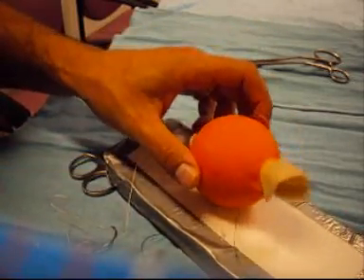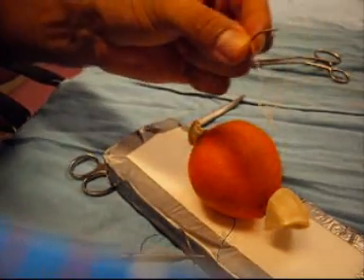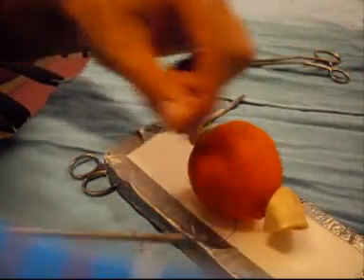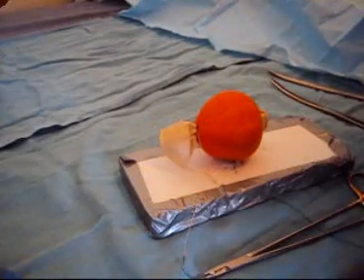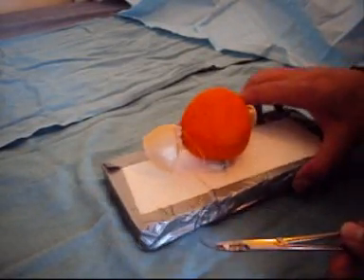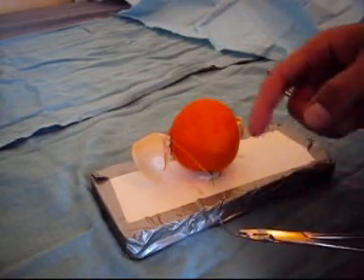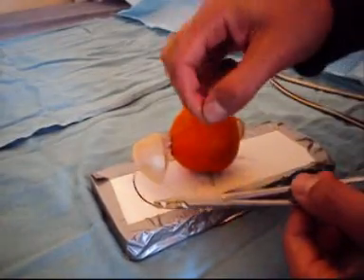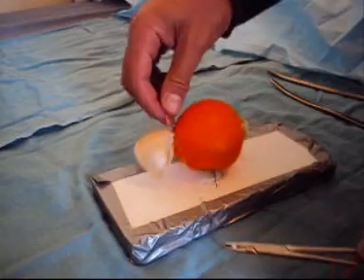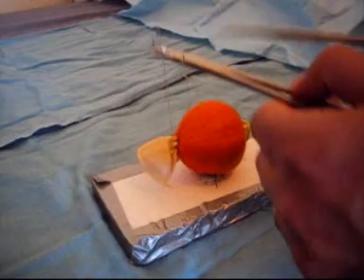We repeat this procedure and tie down. We also tie down the suture from the urethra, bring it back through, and tie it to this end of the balloon. So now we have the model fixed, and rather than having a person hold the model, we have fixed it on the foam with a suture going through the foam and back around, rejoining to the pseudo urethra, which in this case is the balloon.